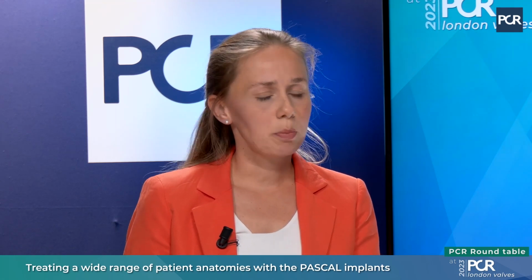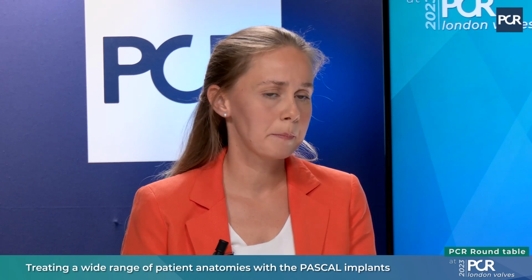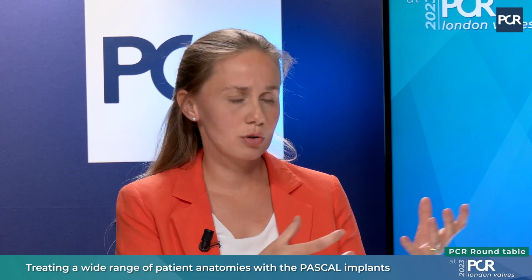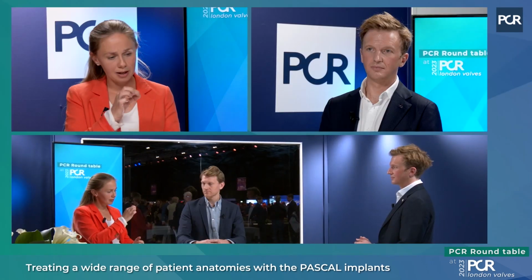Another very important aspect, I think, is that in tricuspid disease, we find much larger coaptation gaps. So often it is not possible to do a simultaneous grasp of the leaflets, but we have to use the independent grasping. And with the PASCAL device, we can really open up to 180 degrees, capture one leaflet, and then swing over to the other leaflet with the so-called Tarzan maneuver and grasp the other leaflet. And I think with this device, we can do it with quite a lot of confidence to not do too much harm to the tissues, because we only have this one row of retention elements, so we don't have too much trauma on the leaflet structure, especially in tricuspid when dealing with this thin leaflet morphology.